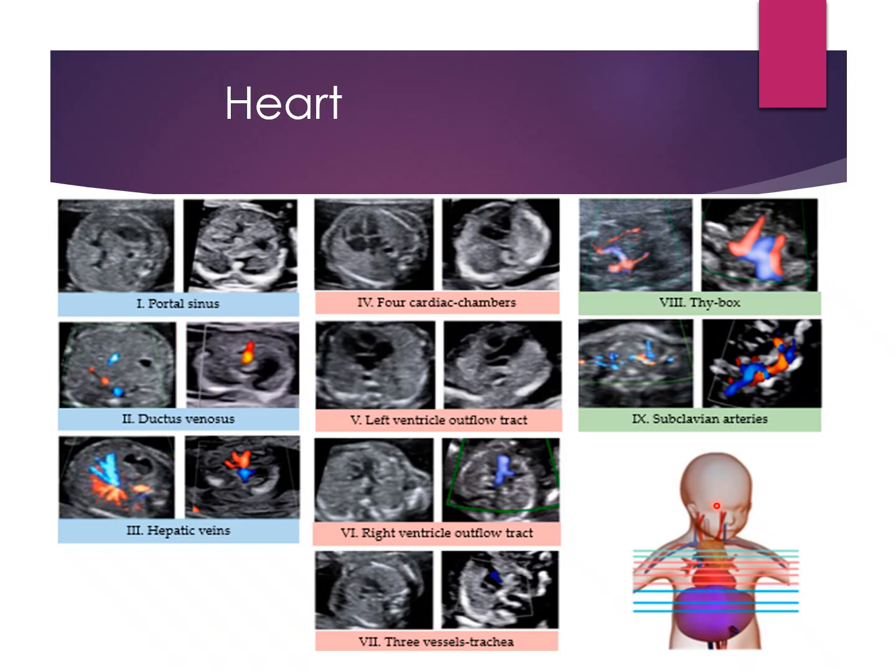And so I want you to picture a baby doll that looks like this inside while you're scanning. So this lower blue here is corresponding to these. This mid-range peach color is corresponding to all of these images, and then this green is corresponding to these. And so if we are starting at the top and we are working our way down, we're going to hit that subclavian. Boom.